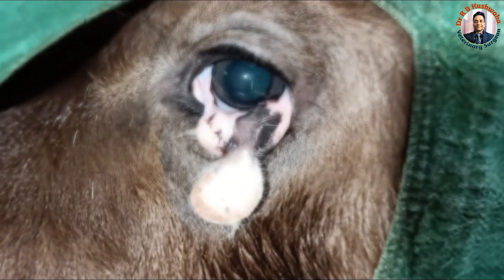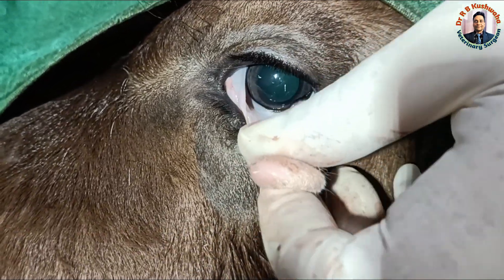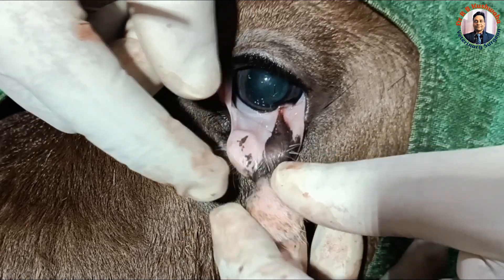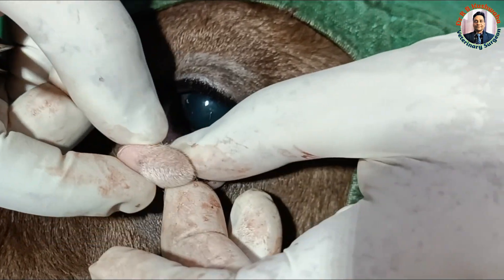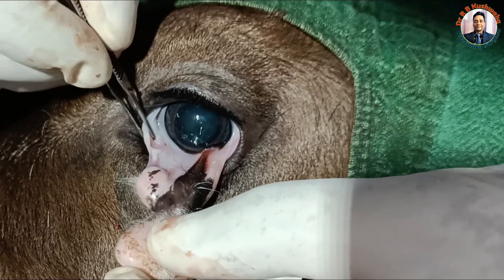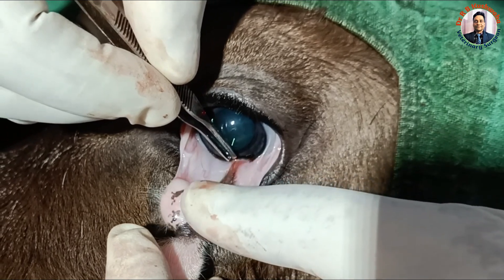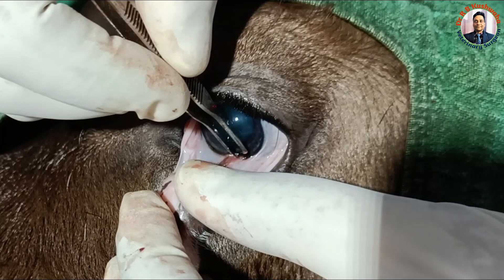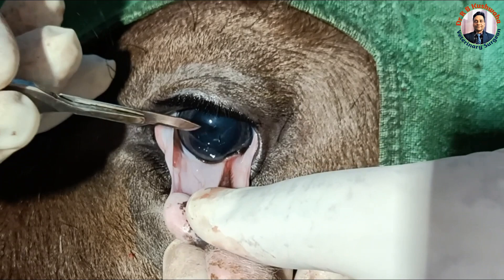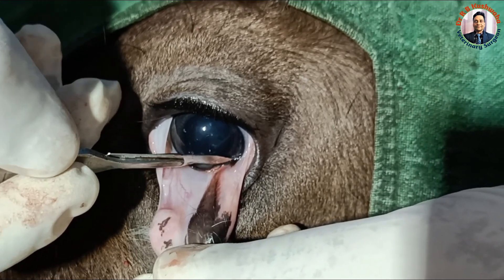We have resected the mass on the right side. Now we will move to the left side, so we change the position of the calf. This eye is the left side, and if you see here, there is a difference from the right side — this is a hairy mass, soft tissue along with hair. Most of the portion is attached with the bulbar and palpebral conjunctiva, with only slight attachment to the cornea.